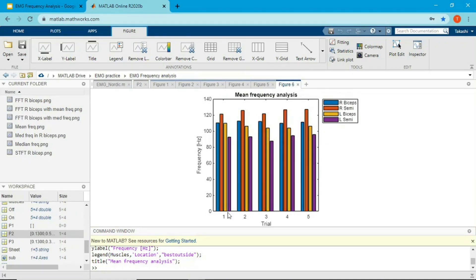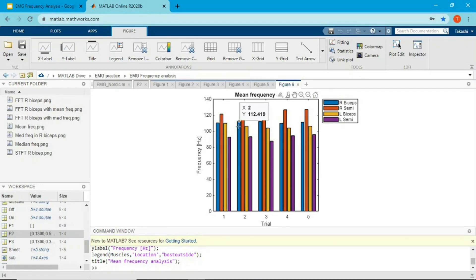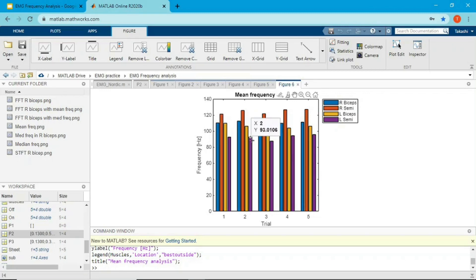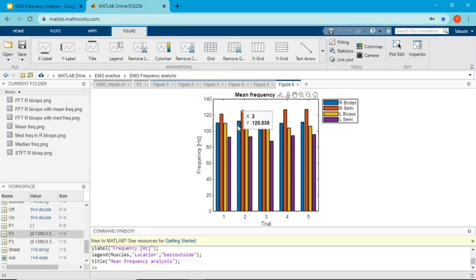The y-axis is frequency and x-axis is trial number. Right semi-tendinosus always has the highest mean frequency, second is right bicep femoris, third is left bicep femoris, and fourth is left semi-tendinosus. As I mentioned in my amplitude analysis video, you can't really compare muscles or trials without normalization — but you can look for patterns across trials.